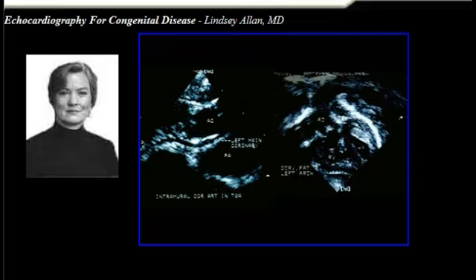So they'd come back from the floors with the echocardiogram, the ultrasound machine, and were describing the intracardiac anatomy to me. And I said to them, well, all that's important for this newborn is that he needs a shunt and what's the side of the arch. And of course they've been so carried away with the other things that they were looking at that they'd forgotten to look at that.